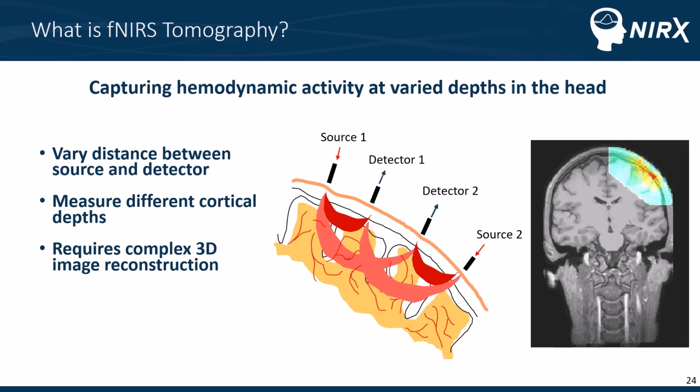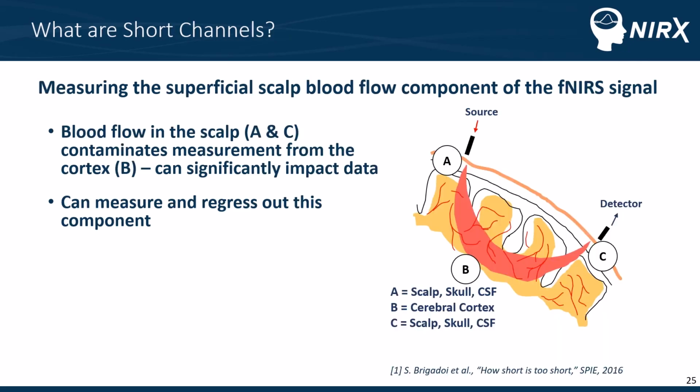So it does require quite a bit of legwork in order to produce these 3D reconstruction images. But with this 3D reconstruction, you can get a better sense of where exactly in the tissue activation occurred. So overall, this is not as commonly used in the field except for short channels. So we saw short channels earlier in that video.